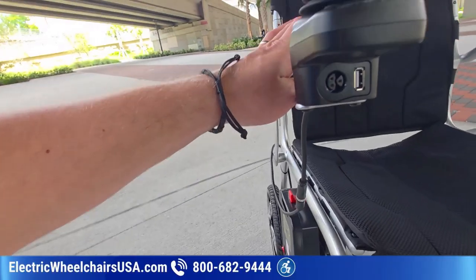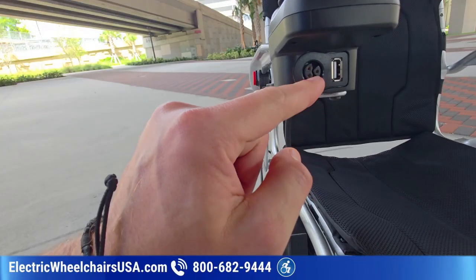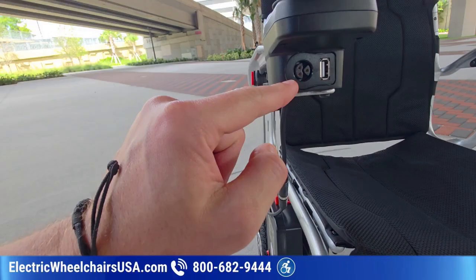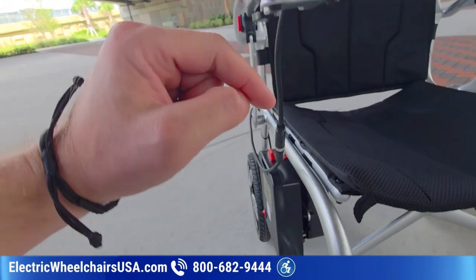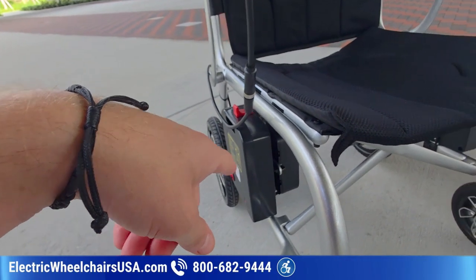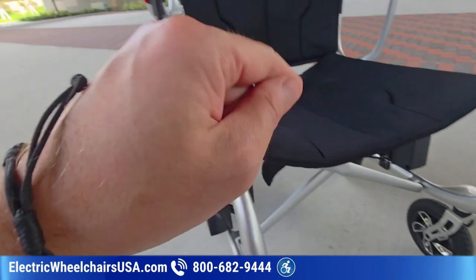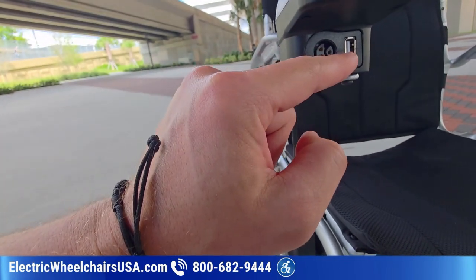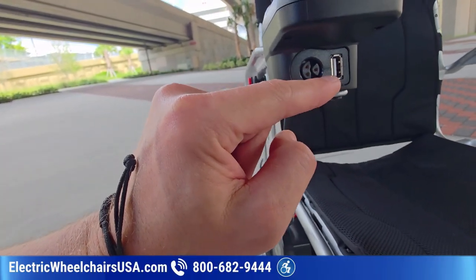As far as charging the batteries, you can charge both of the batteries through the joystick. If both of the batteries are installed on the chair and you want to charge them at the same time, charge them right on the joystick. You can also charge the batteries off of the chair and leave the chair in your garage as an example, but you can only charge one battery at a time. But you have the option to charge both if you want to charge fast. There's also a USB charging port on the joystick, so you can charge your cell phone while you're riding the chair.